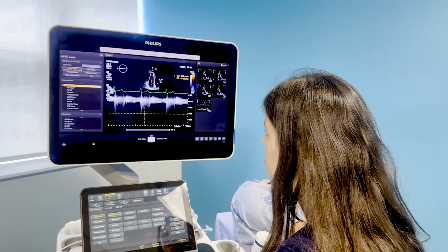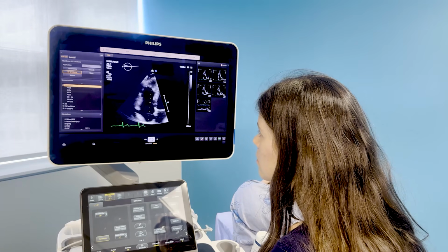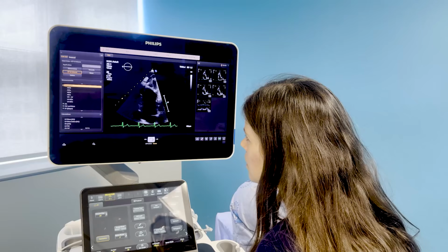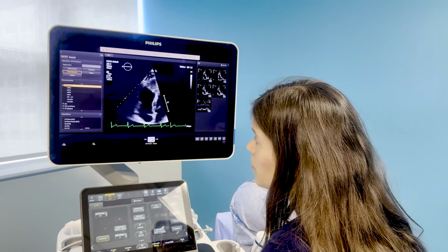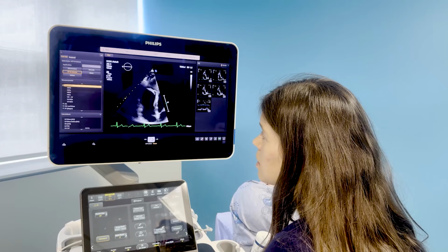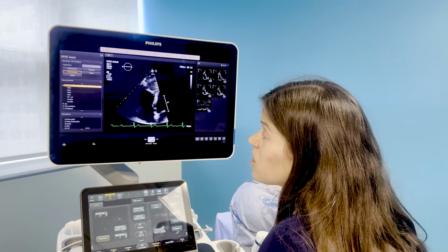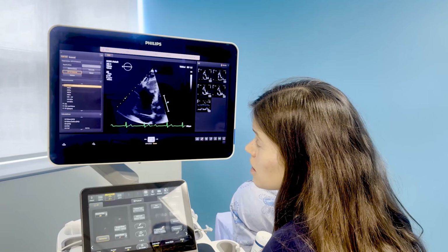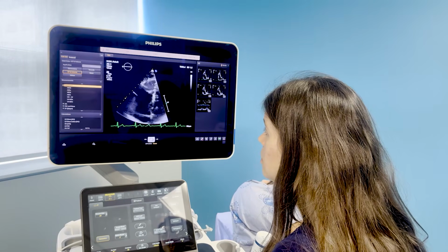Okay. Are there things we can do to enhance the tricuspid regurgitant envelope if we needed to? You could consider doing a bubble study. Agitated saline can enhance the signal a little bit. Right. If you were giving an ultrasound enhancement agent, you could throw a cursor through with that as well. Okay.